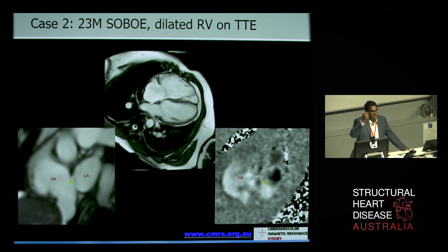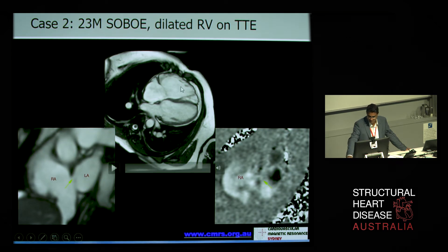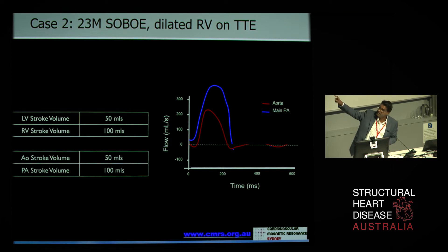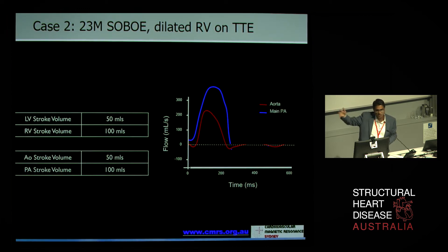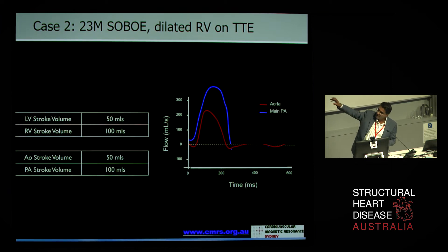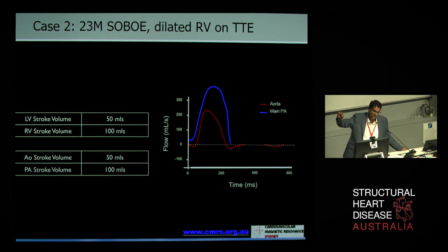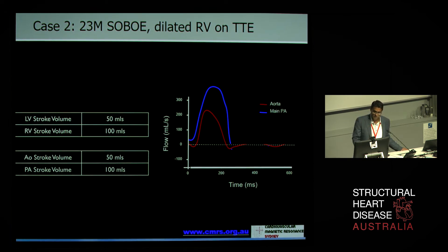Small structures that are very mobile are not so well imaged with MRI because of temporal resolution — that's much more optimal on echo. In this case, we mapped the flow through the main pulmonary artery and the aorta. What you can see from the graph is that the pulmonary artery flow is quite large compared to the aortic flow. Looking at the bottom two panels: the aortic stroke volume is 50 mils and the PA stroke volume is 100 mils — twice that. So what does this mean?